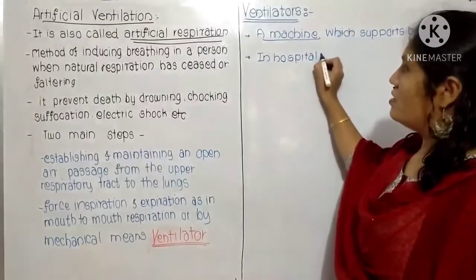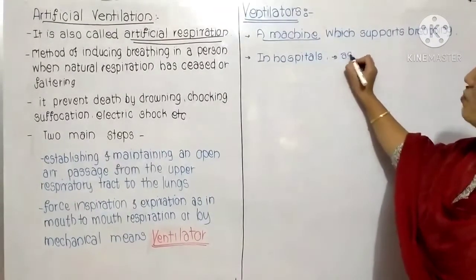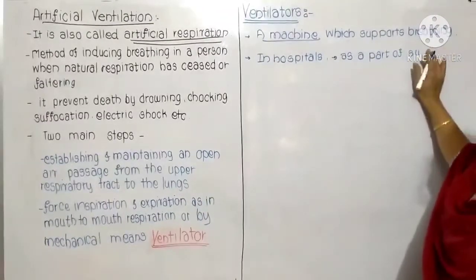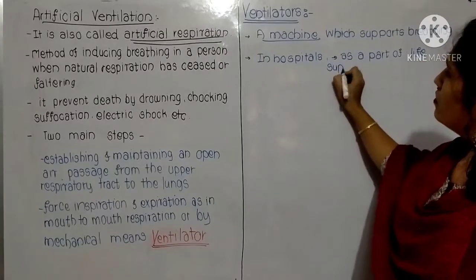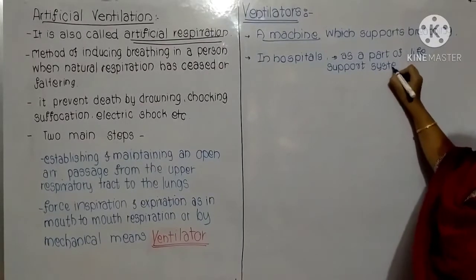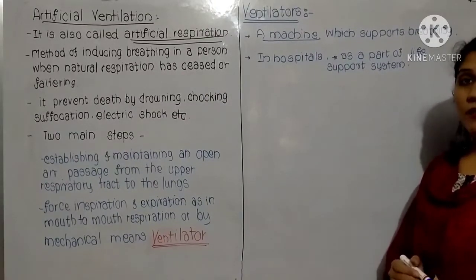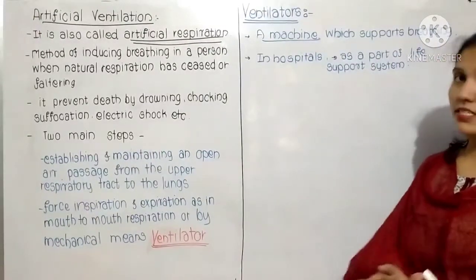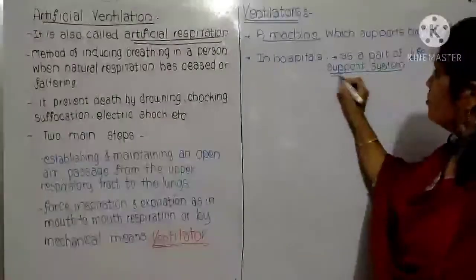It is a part of the life support system, giving that extra support. If a person is not able to breathe properly, naturally, at that time it is useful. It is one of the life support systems.